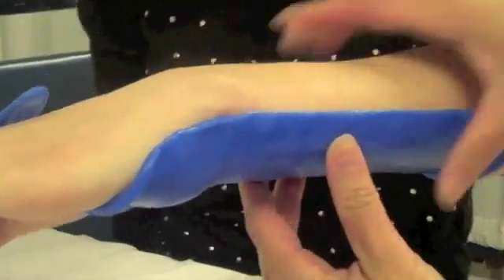Demonstrated here is the patient's wrist in neutral. However, the splint can also be fabricated to position the wrist in extension.